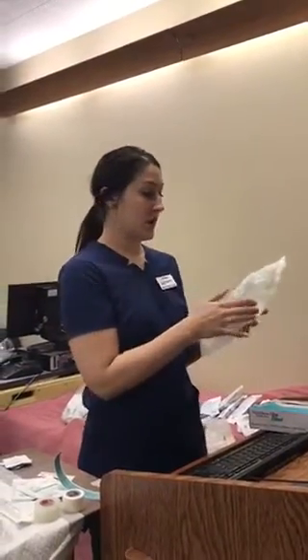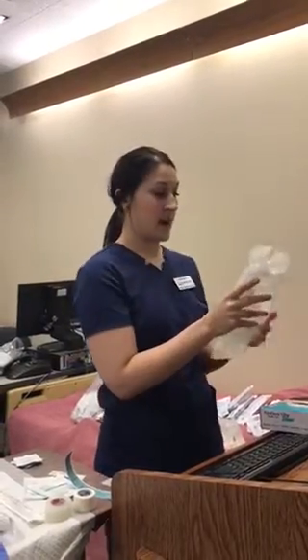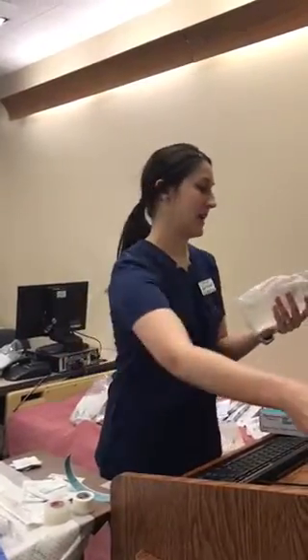So the next thing I'm going to do is pull my saline. So I'm going to see that this is 0.9% sodium chloride, and so this is the right medication that we are administering today. I'm going to go ahead and open that bag.